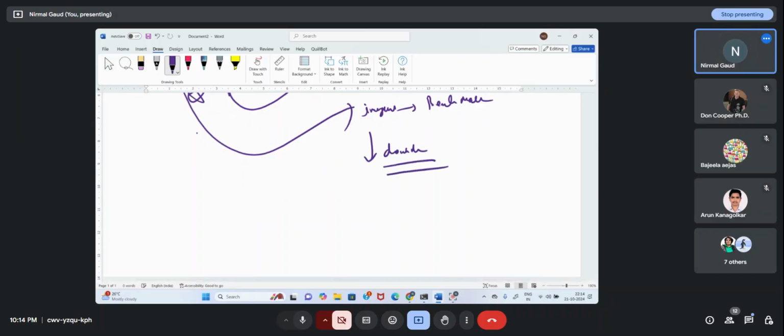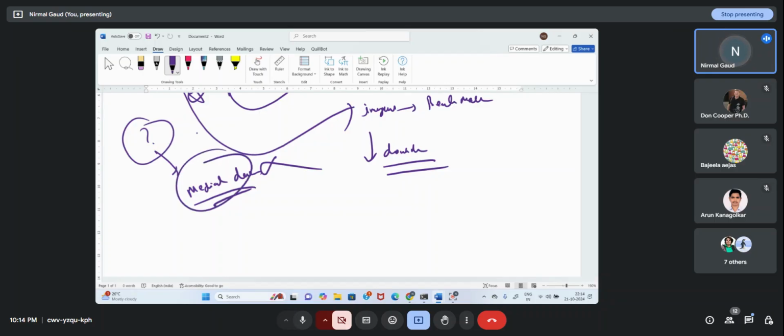One more thing, some people also question, sir, there was no medical data in ImageNet. Medical data is not present in ImageNet. In ImageNet we are having persons, some animals, cat, dog, any other objects, but sir, there was no medical data. And you are right now utilizing this pre-trained model on medical data, sir. So will it work? The question is, will it work?